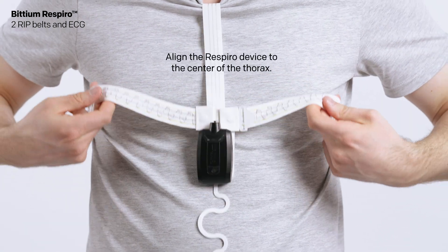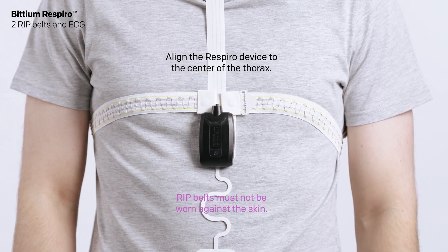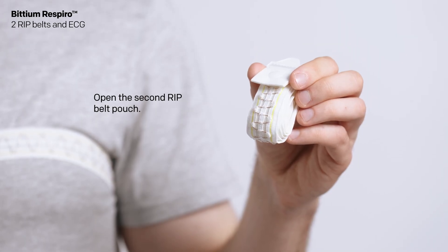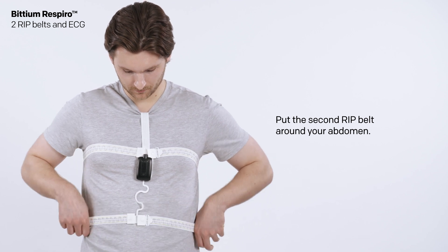Align the Respiro device to the center of the thorax. RIP belts must not be worn against the skin. Open the second RIP belt pouch and put the second RIP belt around your waist and snap into place.